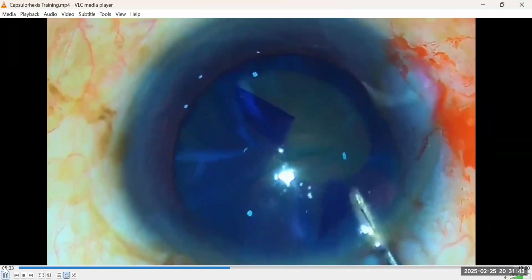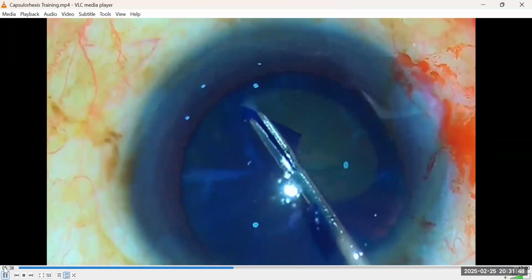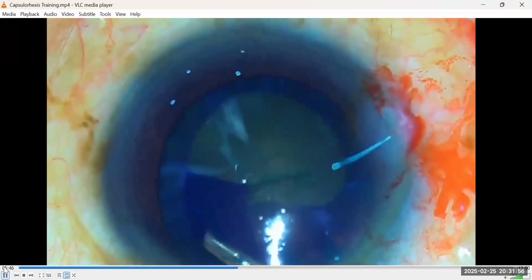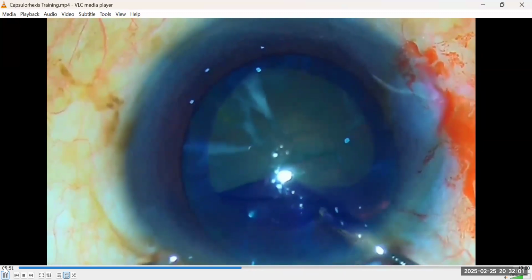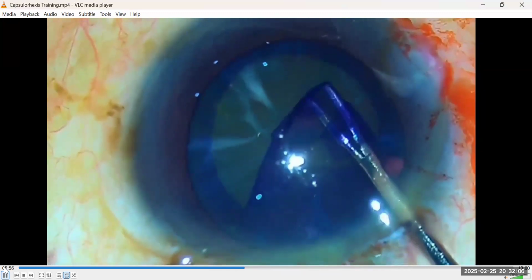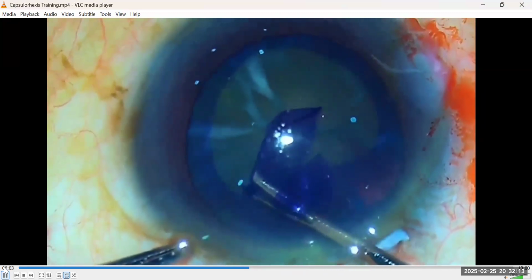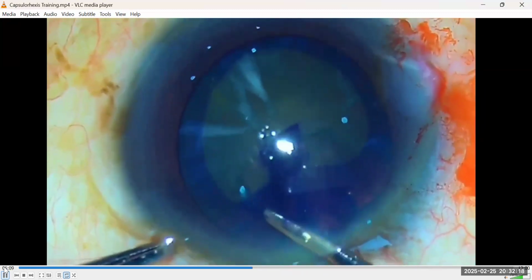When you achieve a puncture, just raise the flap, a short one, so that you'll be in charge, and move the flap of the capsule in your desired direction to your desired perimeter, please. I'm arriving at the difficult areas to the graph, so I'm freeing the flap from my instrument. This is a better axis. All right. I went back to the base. This one, my fulcrum effect is good. Excellent fulcrum effect.